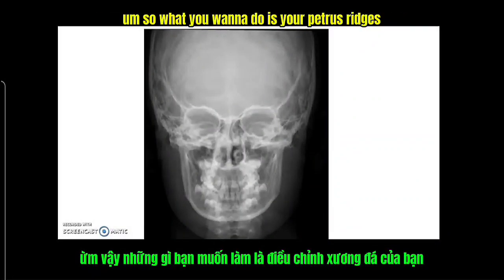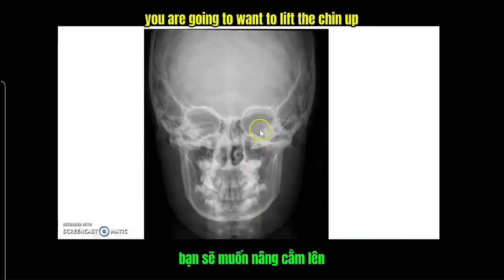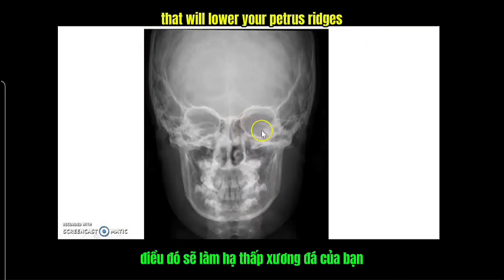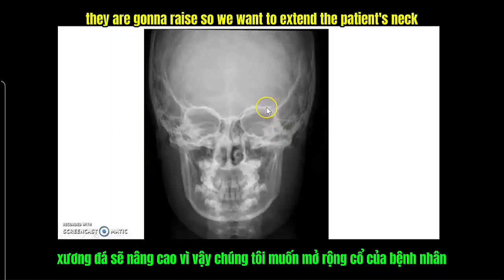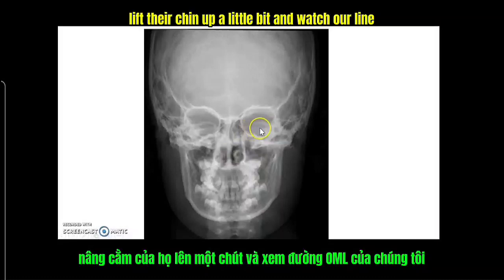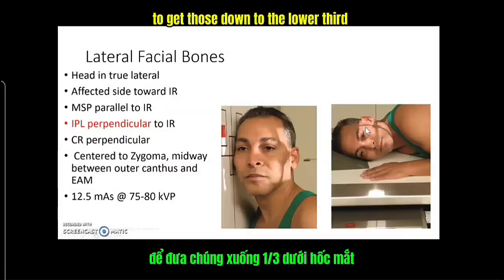So what you want to do is, for your petrous ridges, you are going to want to lift the chin up. That will lower your petrous ridges. If you tuck your chin down, they're going to raise. So we want to extend the patient's neck, lift their chin up a little bit, and watch our line, watch our OML, to get those down to the lower third.